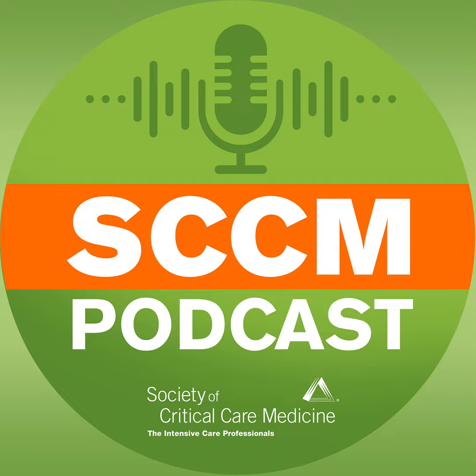But bottom line is, by filling the bag and emptying the bag, you can now have FiO2, as I said, that's different for both patients. You can have a tidal volume that's different for both patients, irrespective of the lung characteristics; the compliance of each lung doesn't really matter. And you can have a PEEP that is different for each of the patients.